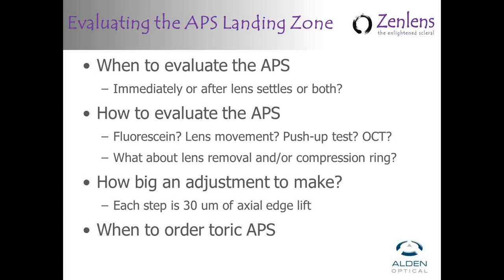I would just assume not see any movement whatsoever. To me, movement means the edges are loose in some area, and that's asking for debris accumulation and fogging, or it indicates that the sclera itself is toric, and you're getting a rocking back and forth of the lens, and that's not good either. Again, a well-fitted scleral to me exhibits zero movement, but it exhibits peripheral curves that with gentle manipulation with the lid give up or allow fluorescein to pass fairly freely.